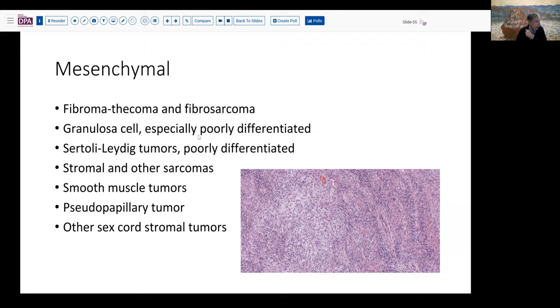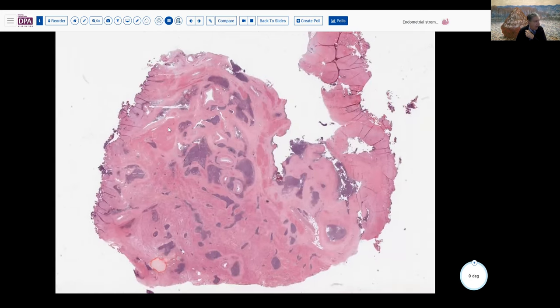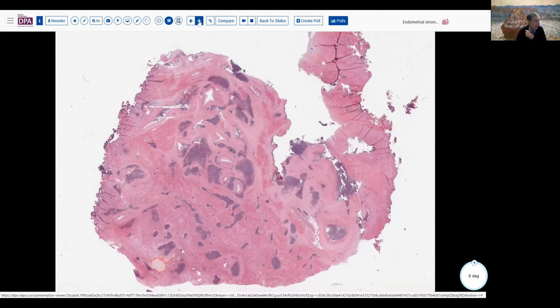Mesenchymal lesions include fibrothecoma, granulosa cell tumors — especially poorly differentiated ones — stromal tumors, sarcomas, fibrosarcomas, and smooth muscle tumors. There is an entity called solid pseudopapillary tumor that has been described in the ovary. Other sex cord stromal tumors like the microcystic stromal tumor or signet ring cell stromal tumor also fit here. Here's our example — the endometrial stromal sarcoma we showed earlier, occurring in the adnexa in comparison.